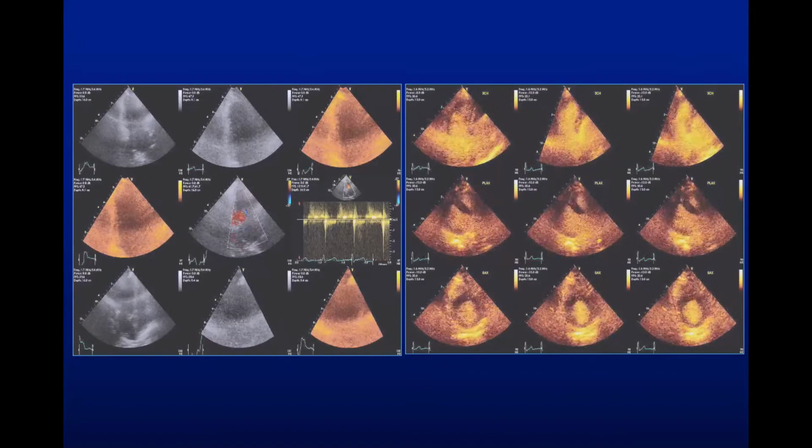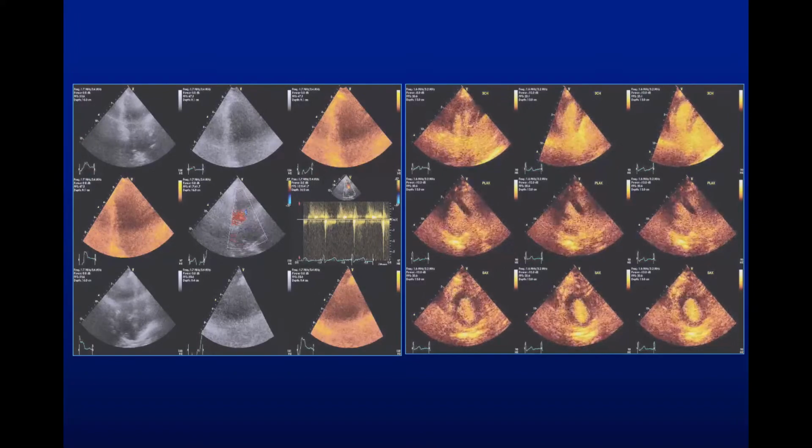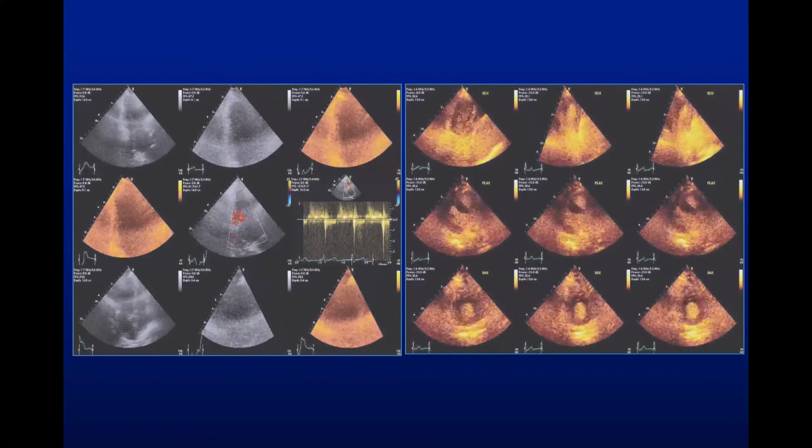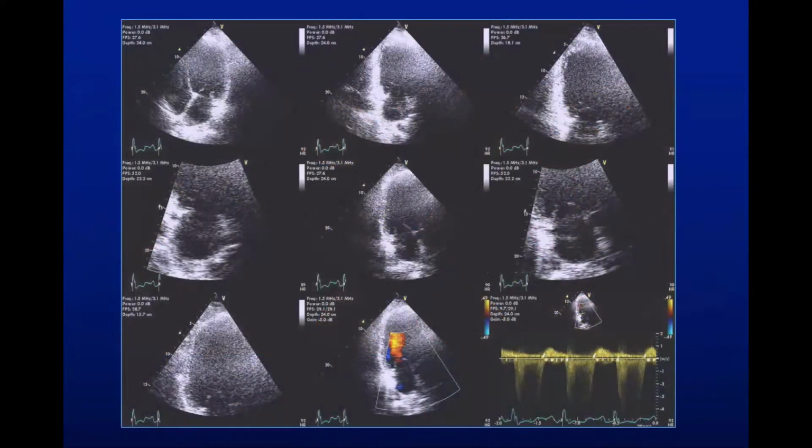I do hope that your laboratories nowadays don't end up with an interpretation on their echocardiogram for the left side to say uninterpretable study, meaning that I would like to push you to make sure that you use ultrasound enhancing agents appropriately in each one of the laboratories. And I think this is very important also to have the equipment with settings and harmonic setting for you to be able to see that.